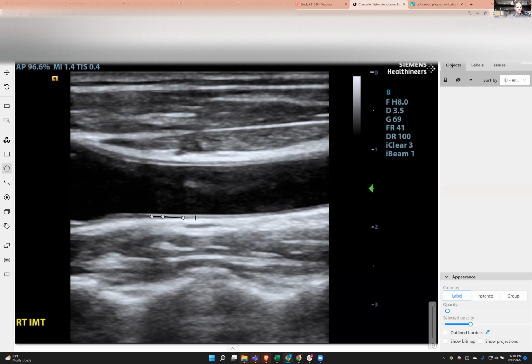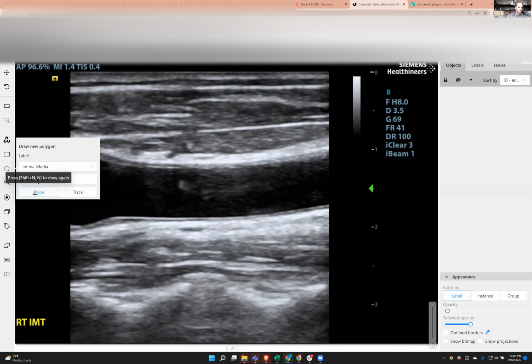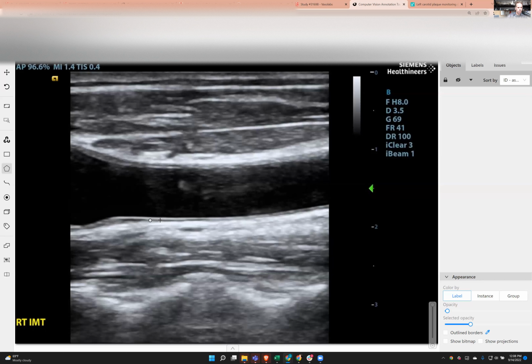I learned how to use an ultrasound machine early in my career, and it's a new sense. I can see inside the body. It's like a miracle. It's a superpower. Anyways, I found out how to deliver this test to doctors and clinics, and my best customers happen to be doctors who prevented heart attack and stroke. In their clinic, they would have a heart attack and stroke prevention program. They would manage their patients, and my test became a huge part of it, an older version of it.